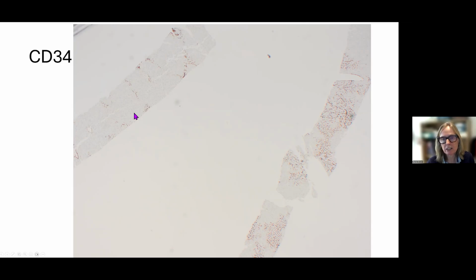So that's the kind of pattern one would expect in normal liver. Whereas in this core, it's clearly different, isn't it? I would suggest it's not entirely diffuse, the staining is still patchy, but what it has given you is an insight into the fact that there is some hepatocellular tissue that's different in this biopsy and could be lesional.